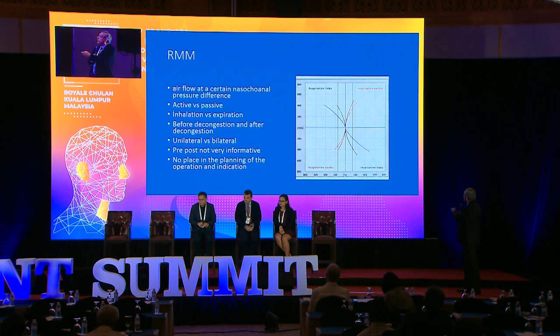You measure the inspiration and expiration unilaterally. But it's mainly helpful after decongestant. Otherwise, it's not very helpful to decide the operation or the indication, but if it allows, you can diagnose nasal valve obstructions in these cases.